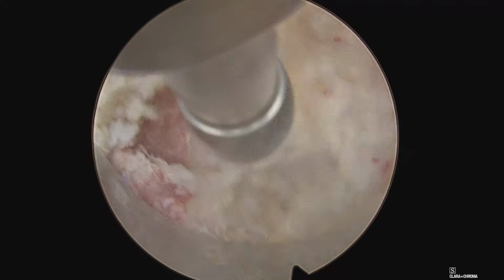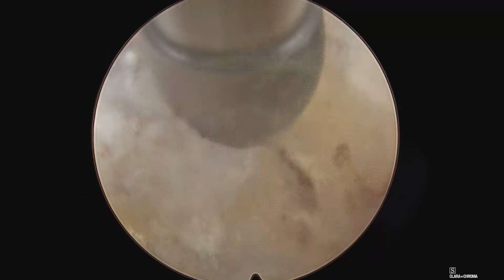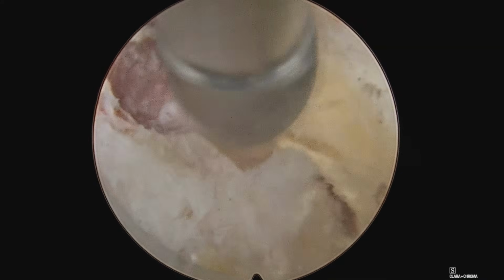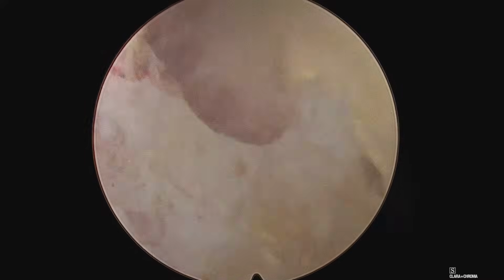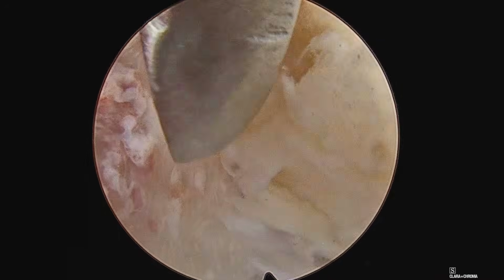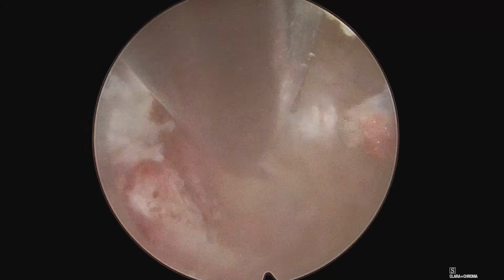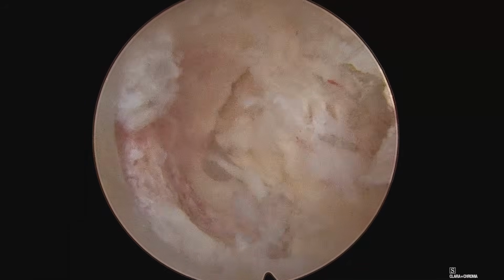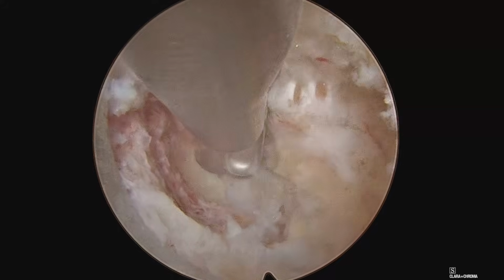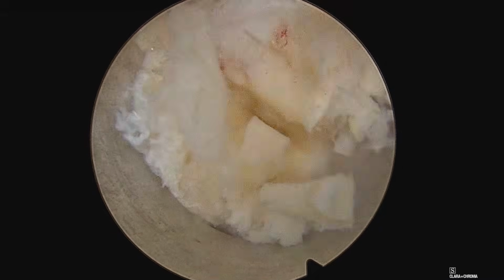The drill is being used to enlarge the interlaminar window, and herein we are also drilling part of the inferior articular process so that we can go lateral to the neural elements. The curette is used to separate the ligamentum flavum from L5 lamina, and rongeurs are used to upcut and extend the interlaminar window. Also, part of inferior articular process is cut.